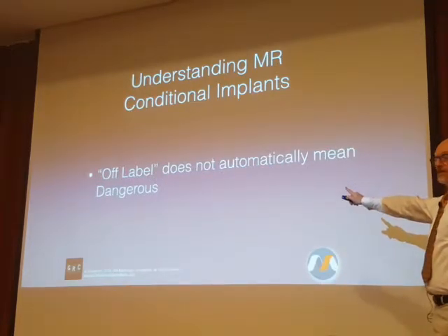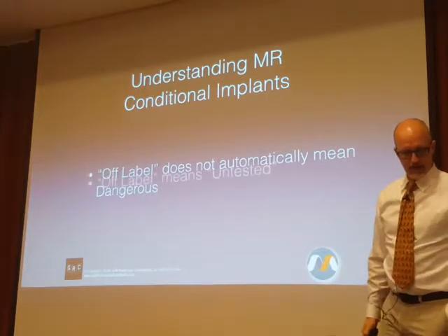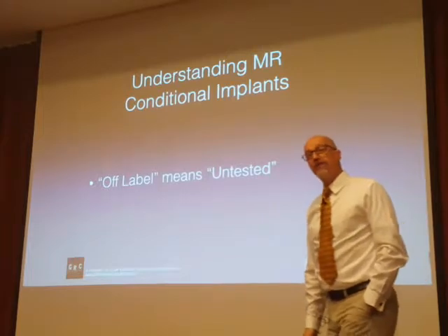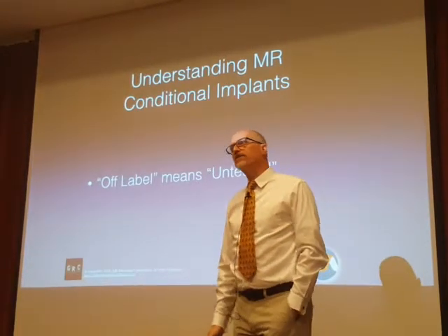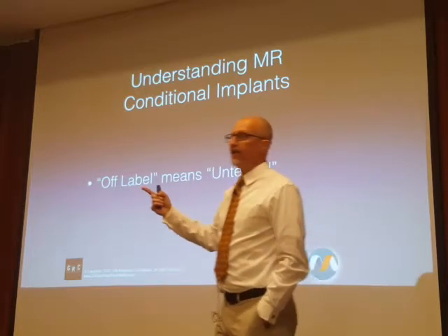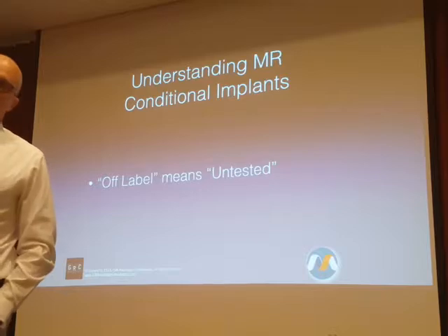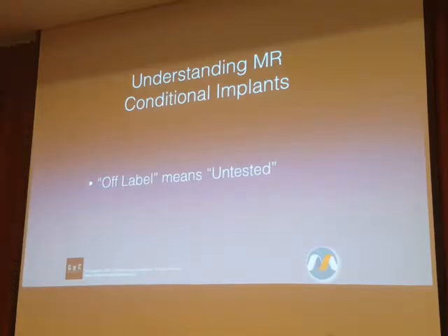Off-label does not automatically mean that it is dangerous. What off-label means is that it is untested by the manufacturer. Sometimes you'll actually find in the literature that somebody puts out an implanted device that gives a ridiculously low RF tolerance, that RF condition, 0.2 watts per kilogram.